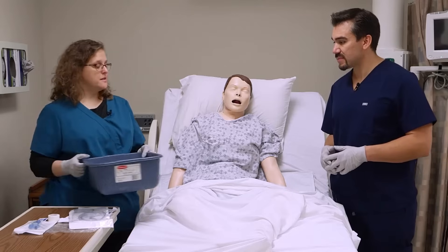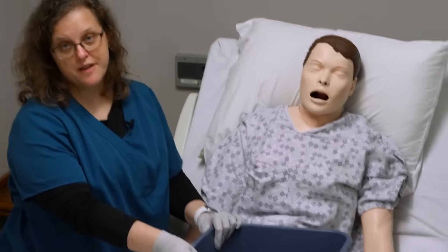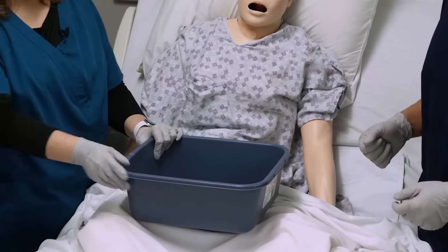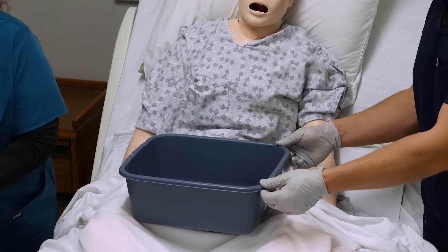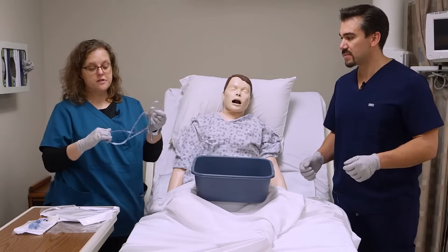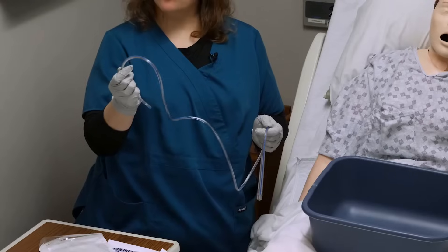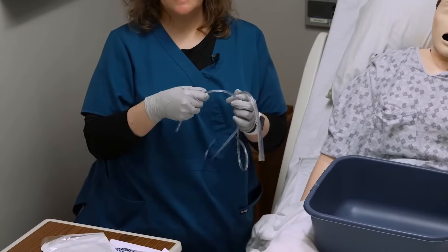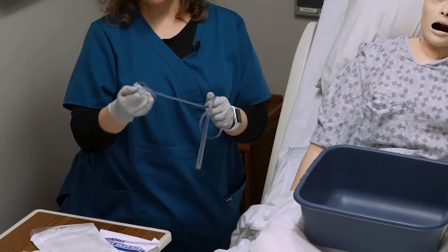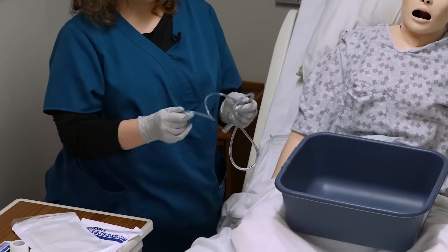What we're going to do is make sure first that the patient has a really large basin in front of them, because passage of the tube could actually make them vomit pretty heavily. Now there are a couple of different schools of thought on the tubing. Some folks say you should get it really cold so that it goes down easier because it's stiff. And some folks like to warm it up and loosen it up so that it's more flexible. There's not a lot of evidence either way, so that's really up to you.